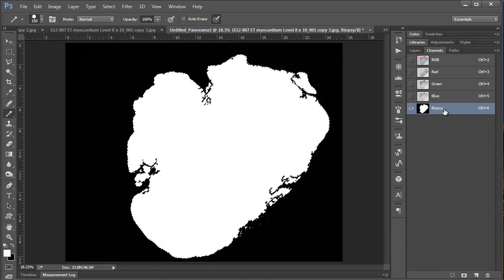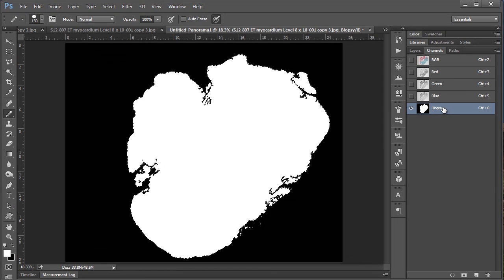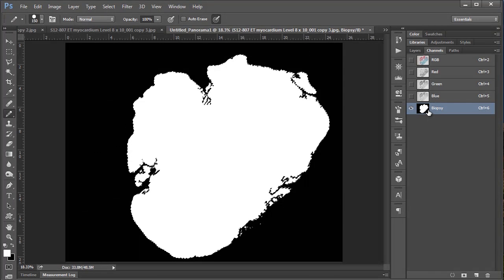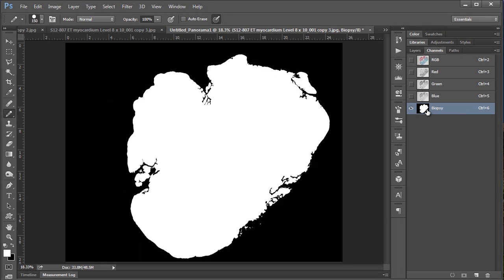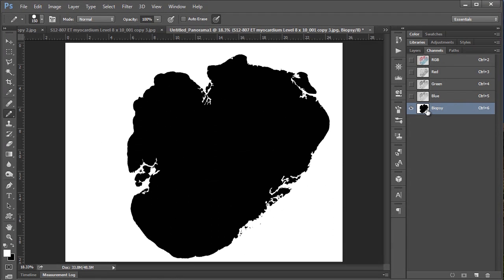And so one thing I want to note is that in Photoshop CC, and I'm not sure when this changed, but compared to CS3 you seem to get the inverse of your save selection here. So if you were in CS3 what you would actually see is this. But for some reason it's now switched to the inverse, which is fine, but it's just something to keep note of so you're not confused.